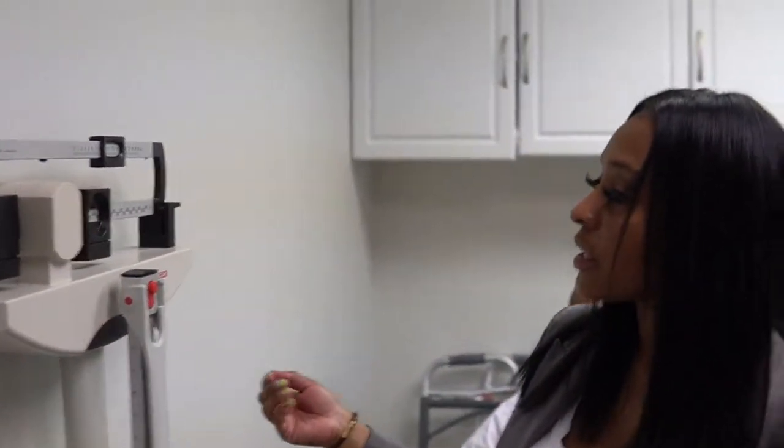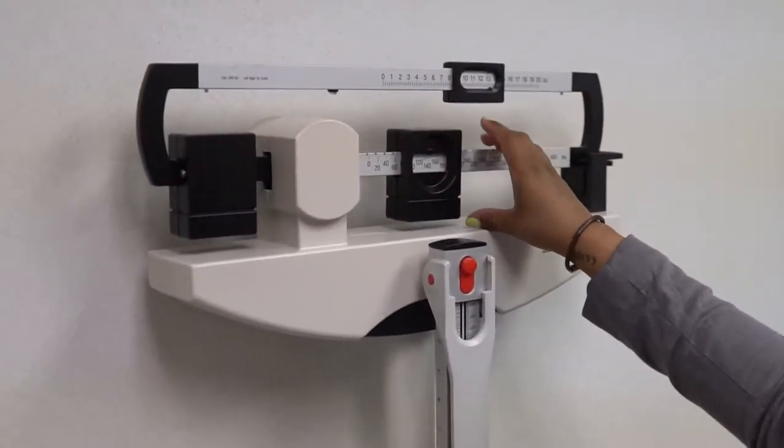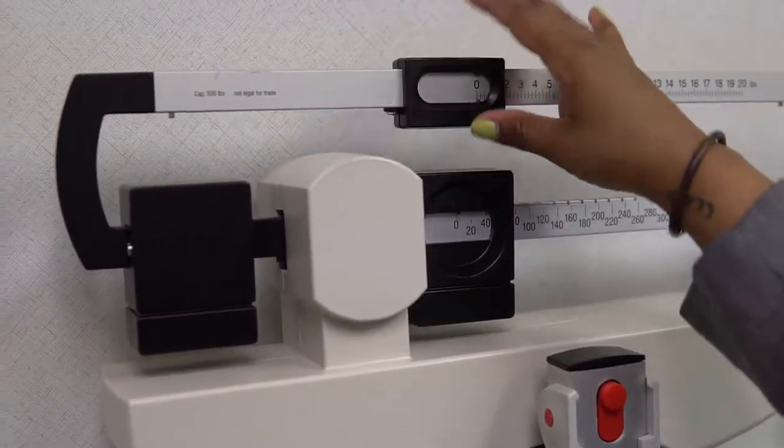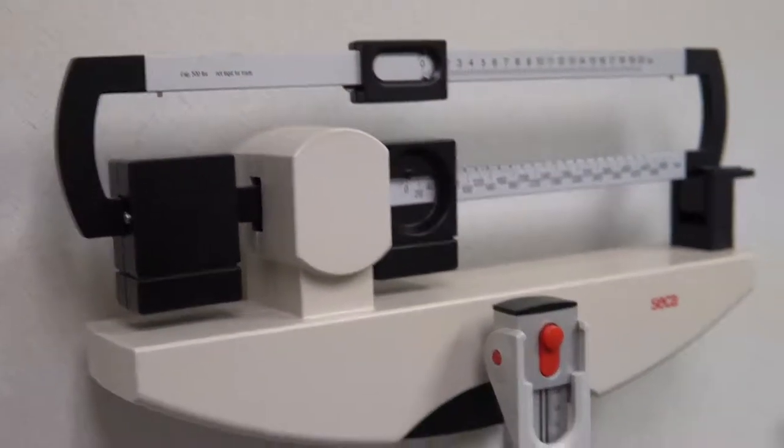Now we have this manual scale, so we're going to make sure it's on zero. I'm going to push all of the notches down to zero before we start to weigh him.